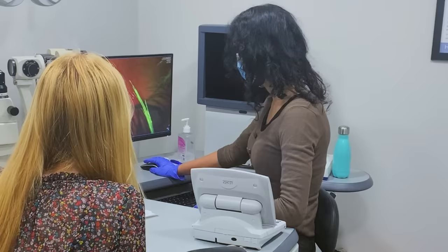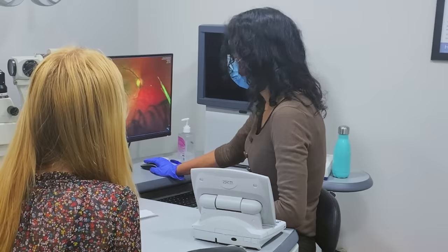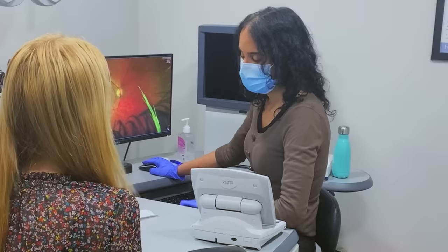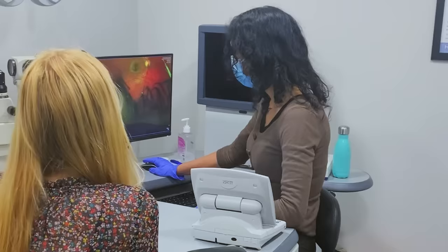Wow. Very good. And this orangey yellowy circle here is the head of the optic nerve. That's the nerve that goes from the back of the eye to the brain ultimately, and it's affected in various eye conditions, most commonly glaucoma, but yours looks perfectly healthy. Also, just to let you know, the pressure inside your eyes is absolutely fine and not too high, which is good, because with conditions like glaucoma the pressure is normally high. This is very good. Excellent.